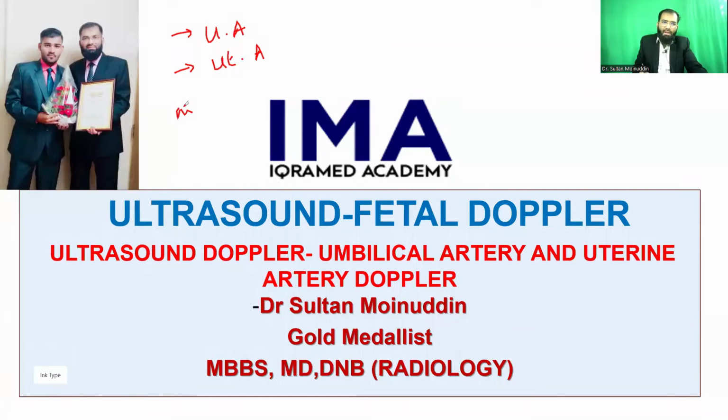Number three, very important, we look for fetal MCA. So when you want to look at the umbilical artery, you see the waveform and you see the various parameters. You calculate various parameters like PI, RI, etc.